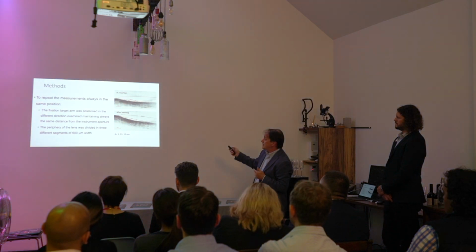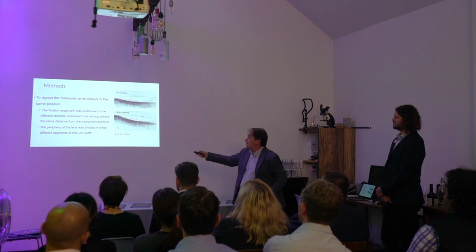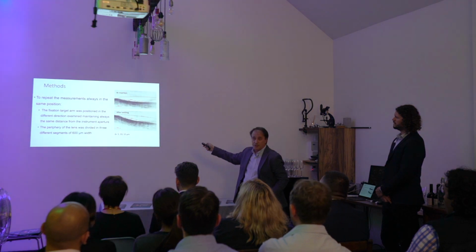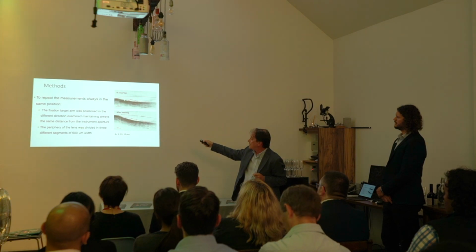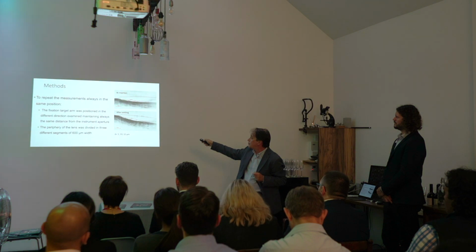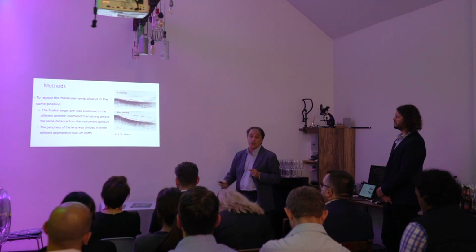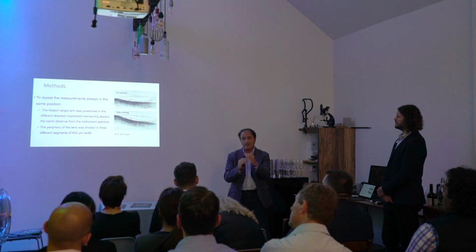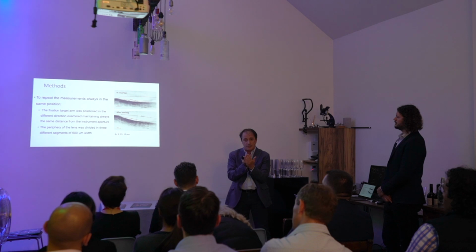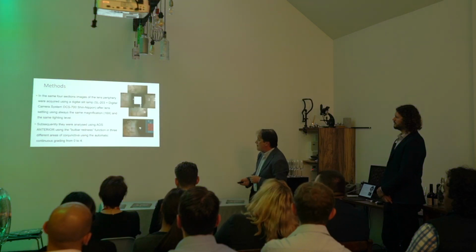And okay, we consider also different positions. So this is the peripheral part, and we divided this part into 3 different places, starting from the edge of the lens, to always obtain measurements very, very close with the slit lamp and with the OCT.